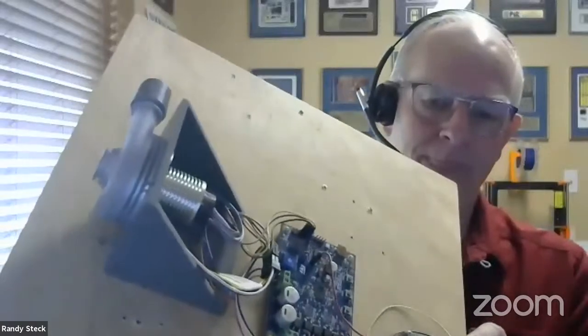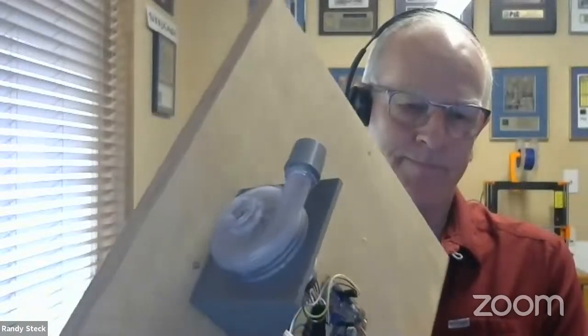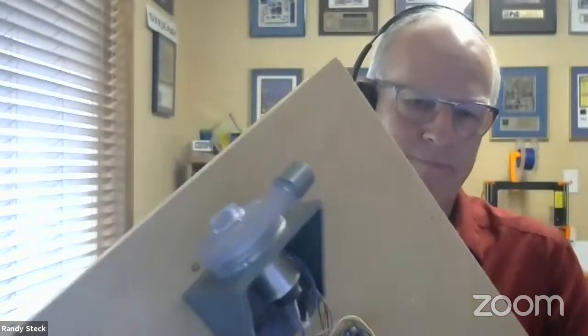There's a software branch for the embedded code which basically does that. The blower is far not as well tested as the AMBU bag, but it is an option to expand this further and test further. It's for sure the nicer, more robust and smaller version, and it's not depending on the stepper motors, which are of varying availability and quality. So yeah, it has advantages.